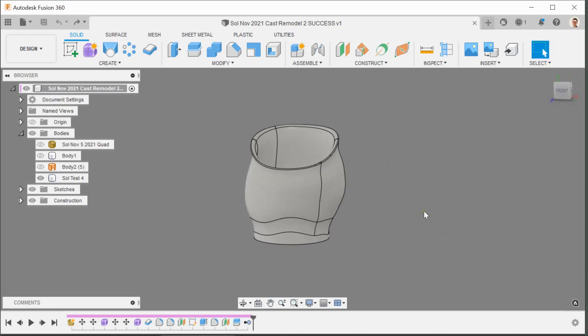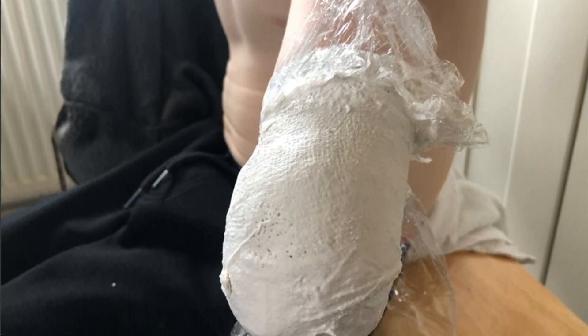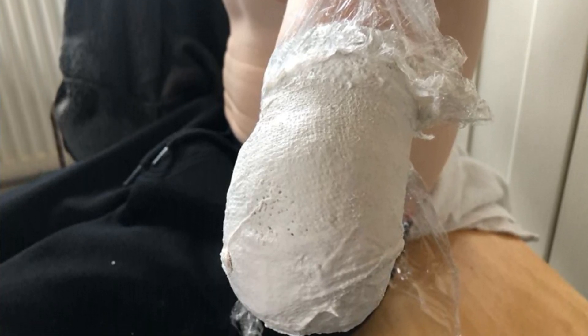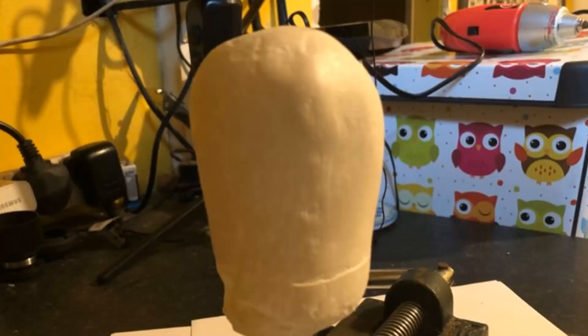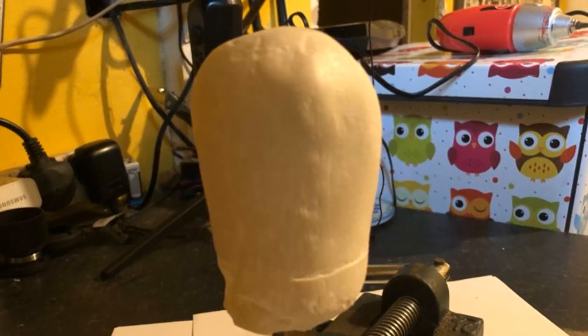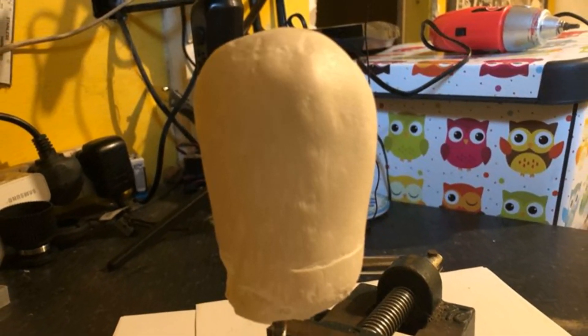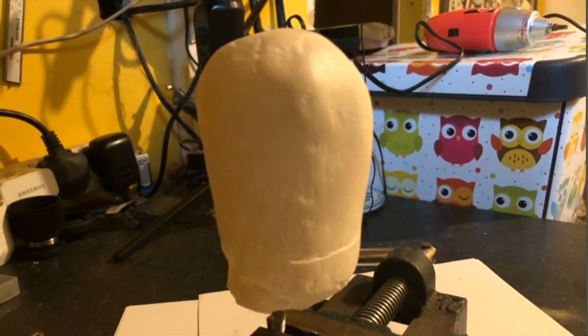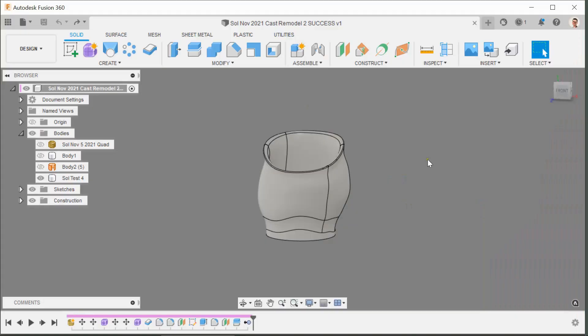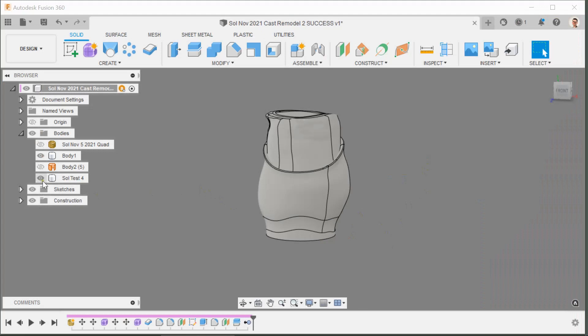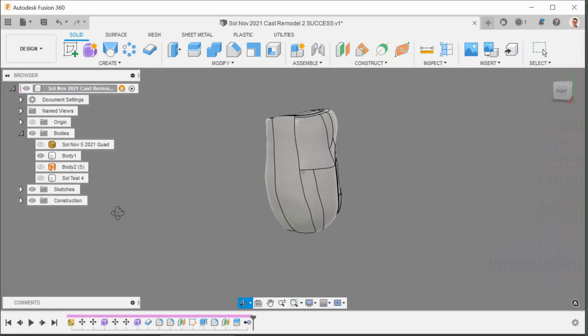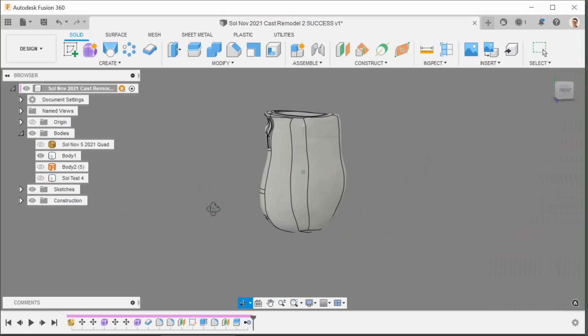This is a digital socket that was created from a 3D scan of a physical cast. We took the cast in our kitchen back in November, made some corrections with a file, then scanned the plastic positive and imported that as an OBJ quad into Fusion 360. This body resulted from that process — that's Sol's positive.